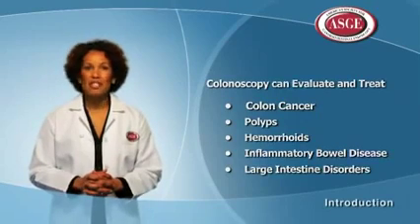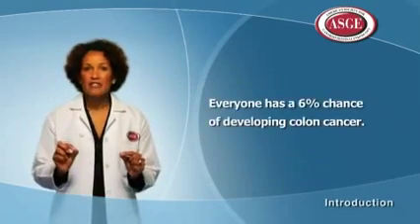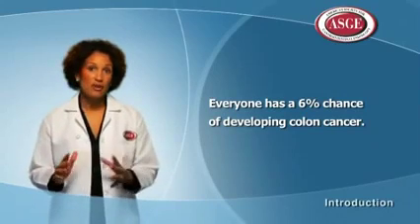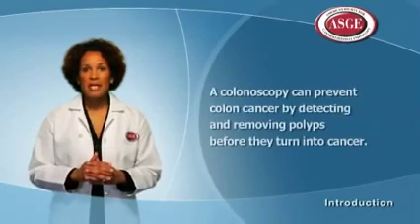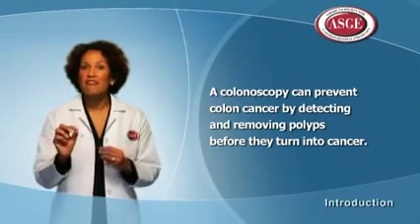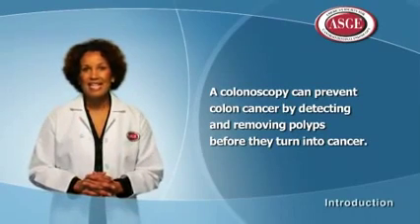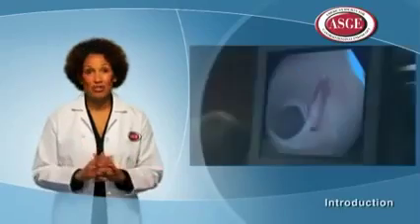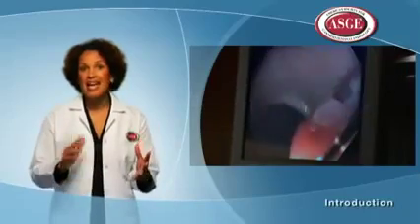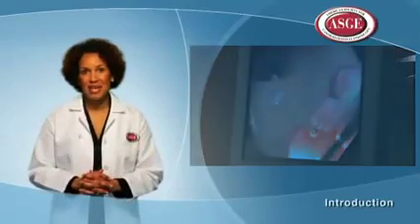Let's go back for a moment to colon cancer. Every individual has a 6% risk of developing colon cancer over his or her lifetime. Colonoscopy can prevent colon cancer by finding polyps and removing them before they can turn into cancer. It is the best test we have for screening for colon cancer and is the only test that can both find and remove polyps at the same time.